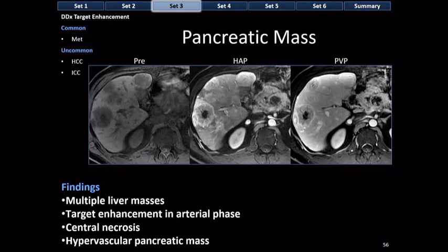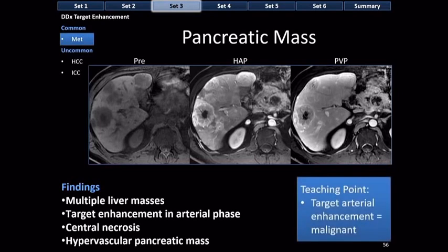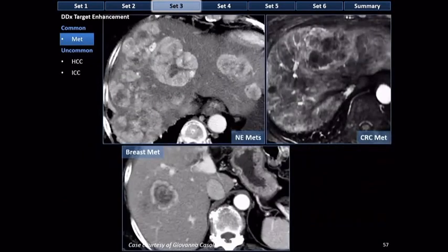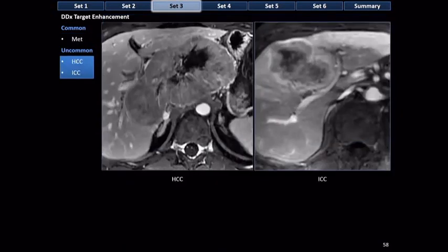Here are more examples of target enhancement: neuroendocrine mets on CT, colorectal cancer metastasis on MRI, breast cancer metastasis on CT — target enhancement is a feature of metastatic disease. But target enhancement can also be seen in hepatocellular carcinoma and cholangiocarcinoma. To summarize: target enhancement is either a metastasis, an HCC, or a cholangiocarcinoma.